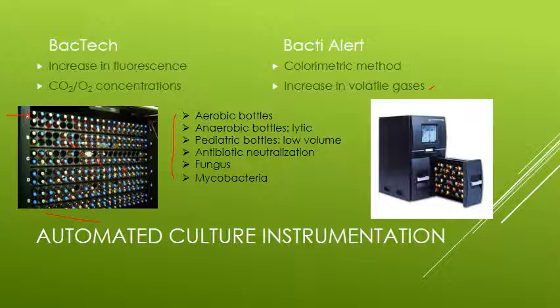So by having that charcoal neutralization, you can argue with the insurance company that, hey, we took steps to make sure that the antibiotics were not part of this culture. So that's important to remember, and it's something that all labs really should consider keeping on as part of their stock, and let the doctors know that it's there.